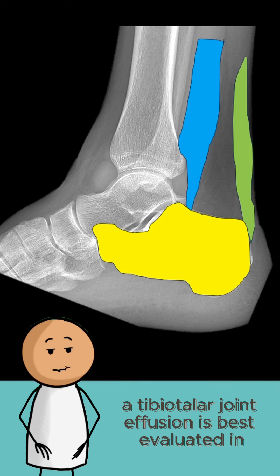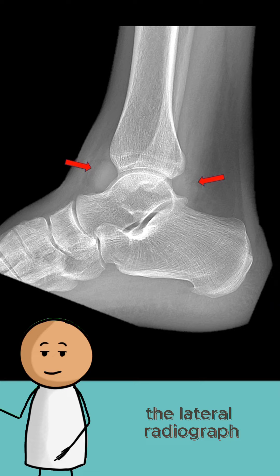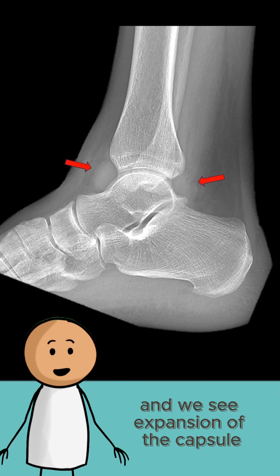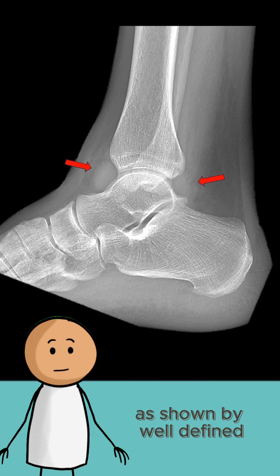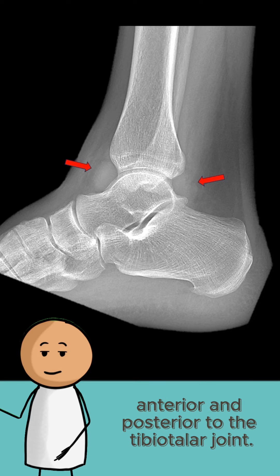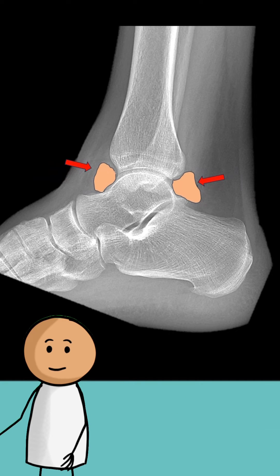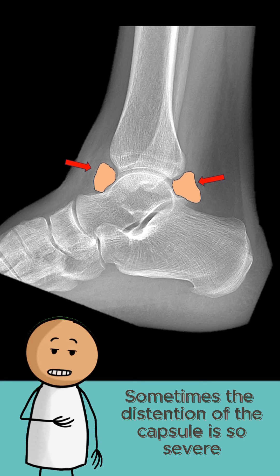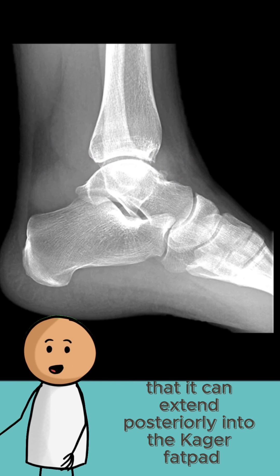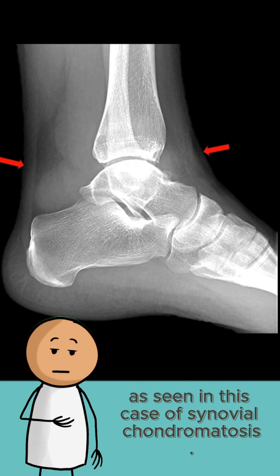A tibiotalar joint effusion is best evaluated on lateral radiographs, and we see expansion of the capsule as shown by well-defined, rounded densities anterior and posterior to the tibiotalar joint. Sometimes, the distension of the capsule is so severe that it can extend posteriorly into the Kager's fat pad, as seen in this case of synovial chondromatosis.